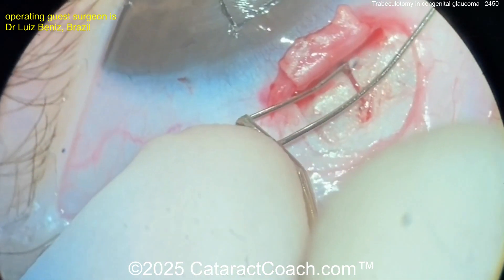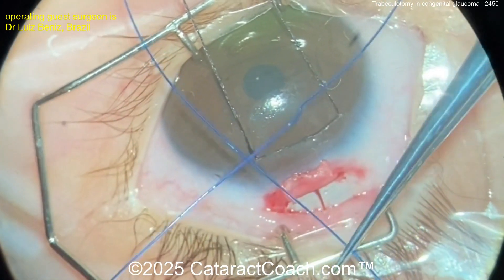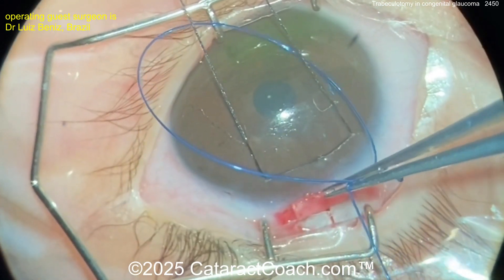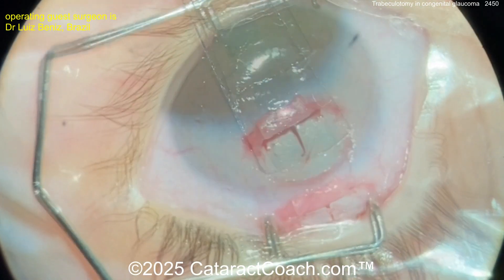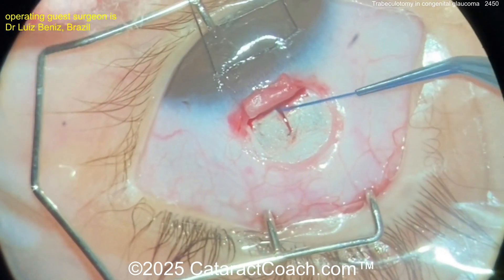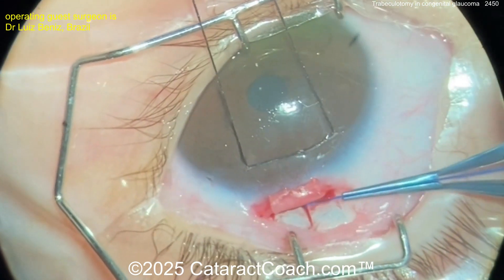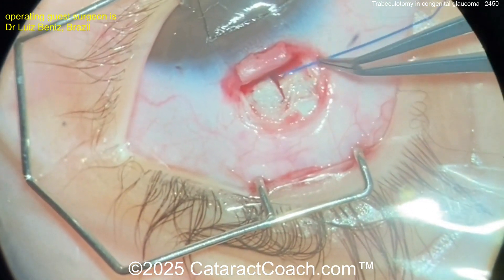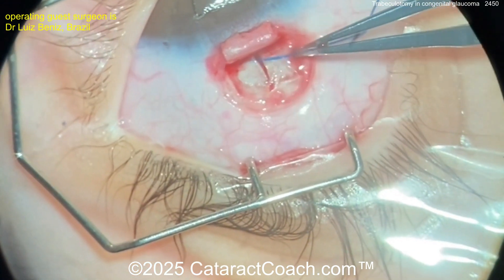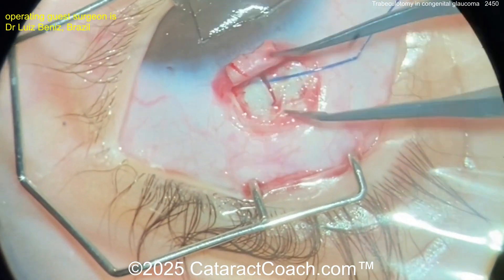It really should go through pretty smoothly. Now why are there two prongs? It's to show you where the other prong is inside. Here we go — there's a prolene suture circumscribing the cornea, causing a little bend there. Very nicely done. This is going to be done with a suture now for a full 360 degrees. You're going to pass the suture all the way around — there's a prolene 5-0 on edge.